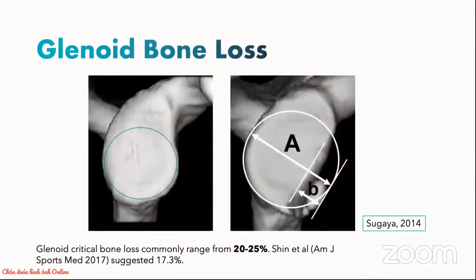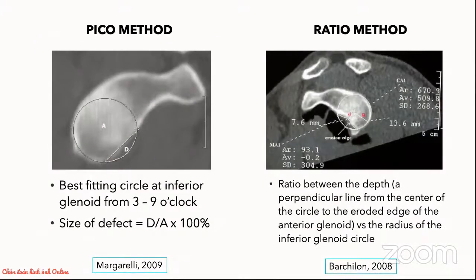If you view the glenoid en face using a 3D reconstruction, you should be able to appreciate a slightly pear-shaped appearance of the glenoid articular surface as shown by the image on the left. At the inferior half of the glenoid, normally you will be able to fit a best-fit circle fully. The image on the right shows a patient with shoulder instability and glenoid bone loss; the deficiency of the best-fit circle inferiorly annotates the degree of bone loss. Commonly, critical bone loss can range from 20% to 25% according to surgeon preferences. If you do not have access to 3D reformats, there are also other established measurement methods to quantify degree of glenoid bone loss on sagittal CT reconstructions of the scapula, such as the PICO method and the ratio method.